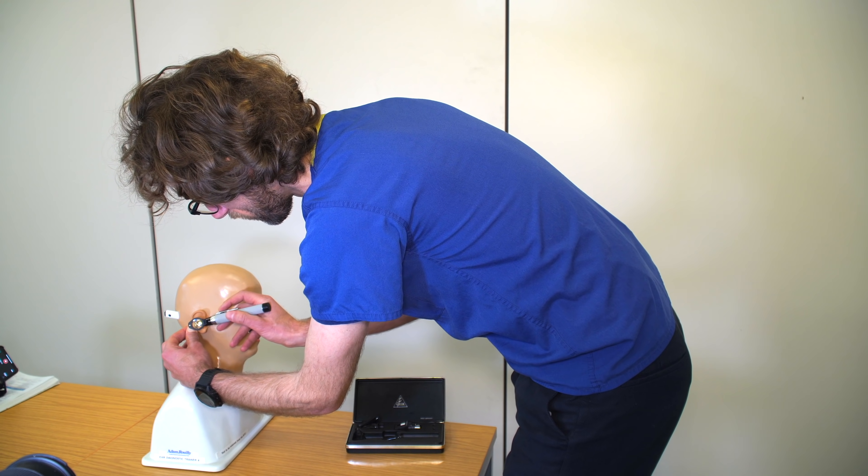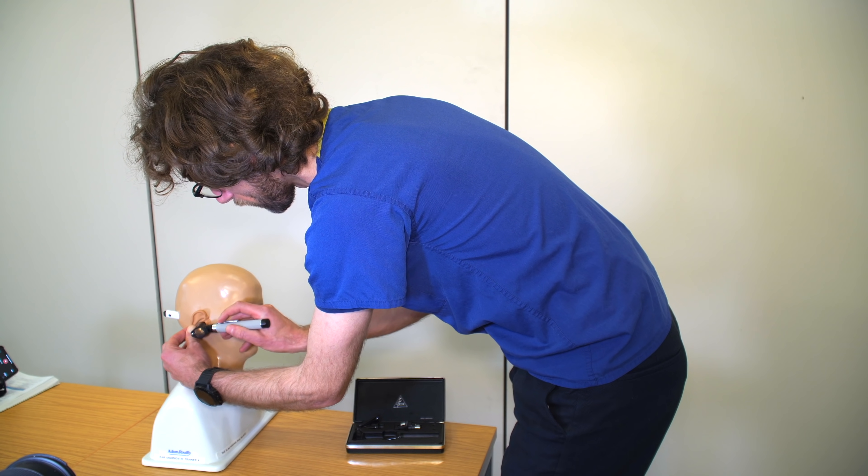One of the reasons I felt we needed to address this was because I frequently see students in the general practice environment who are struggling with this examination. It's actually quite intimate — you're going to be taking the otoscope and putting a little bit of plastic into someone's ear and wiggling it around to try and see what's going on. For anybody coming in with earache, putting a speculum inside the ear is unlikely to decrease that discomfort. So it's understandable this is quite a nerve-wracking examination for students.